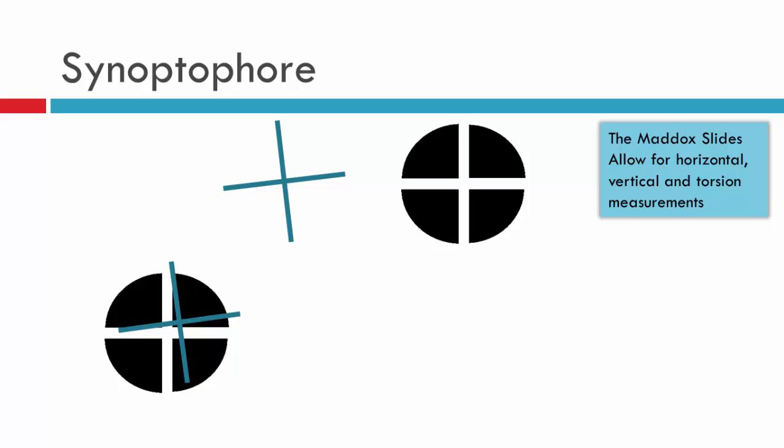The issue with this test is that sometimes when the cross starts to move out of the centre, and you will have experienced being on the Synoptophore and the line, for instance, sometimes being in the cage and then slowly moving out of the cage and then coming back into the cage, that dissociative nature of the Synoptophore can make it difficult for patients to continually try to ensure that the cross is in the centre and orientated in such a way that it sits perfectly within that circle.